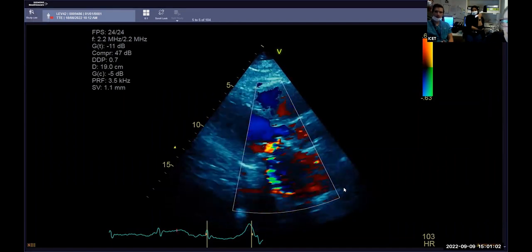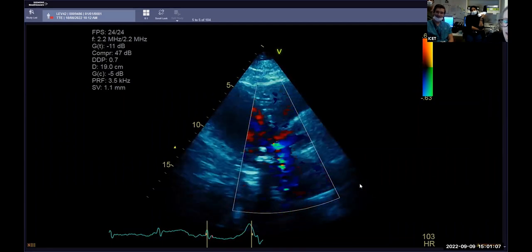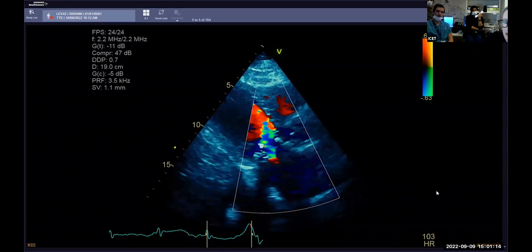And we're still at 63. We're still at 63 in the jets. The color jets are reaching the back of the atrium, though. Which immediately, I think we can say it's significant. Significant, yeah, for sure. It's certainly not mild. Could be severe. Could be moderate.